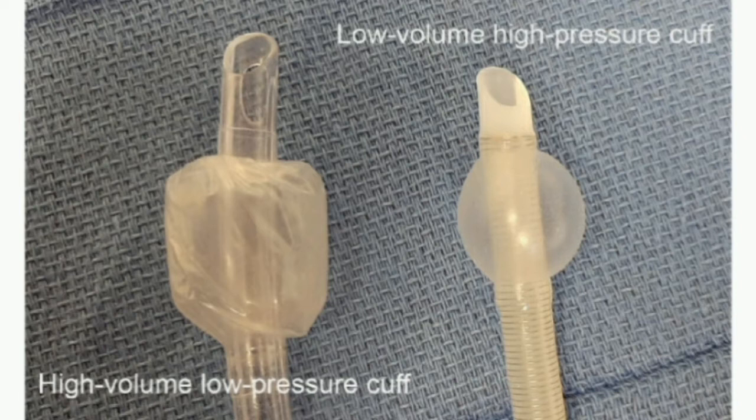Low volume, high pressure cuffs have a lower volume and the surface area in contact with the trachea is small. This results in a high pressure seal that is more effective than the one provided by high volume, low pressure cuffs. However, this high pressure is more likely to cause tracheal ischemia and necrosis if used for a prolonged period of time.